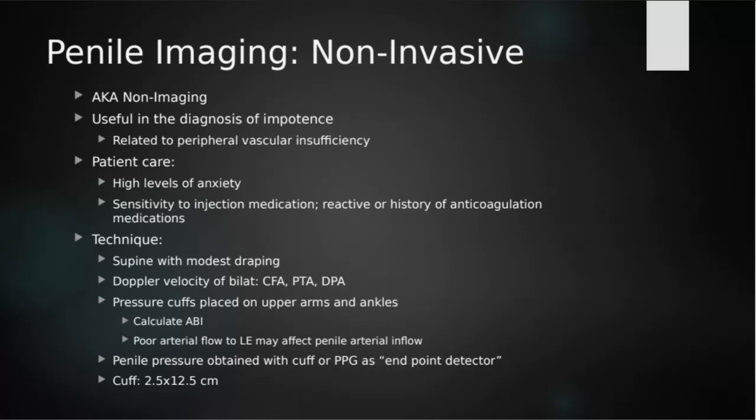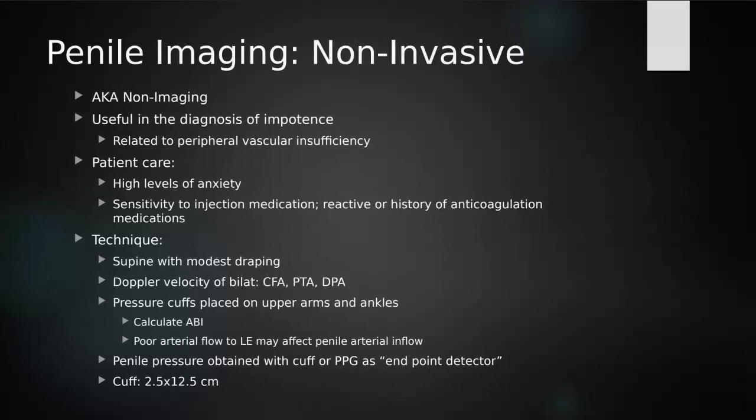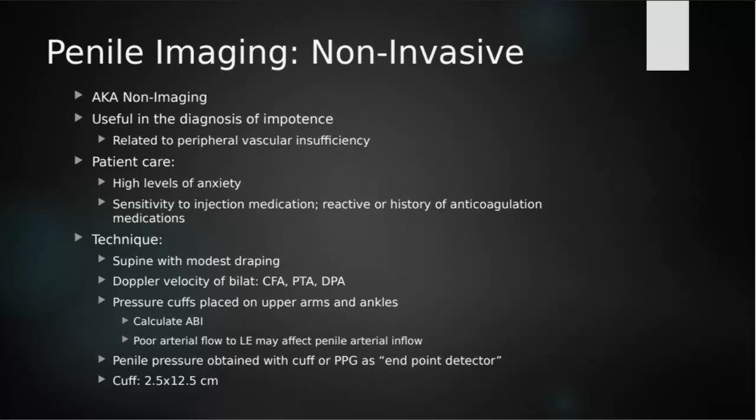Now, with this non-imaging or non-invasive type, it's kind of like a play on words, because we're literally injecting them. So, to me, that's pretty invasive. But we're not really relying on imaging for this. We're really relying on just our PPG waveforms, and some of our waveforms up in those higher vessels and those pelvic vessels of the common femoral artery.